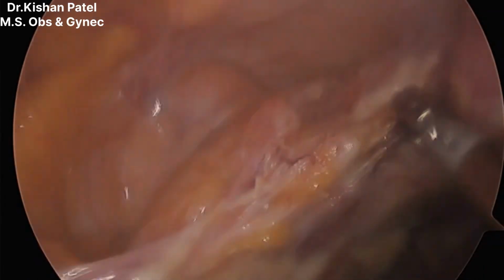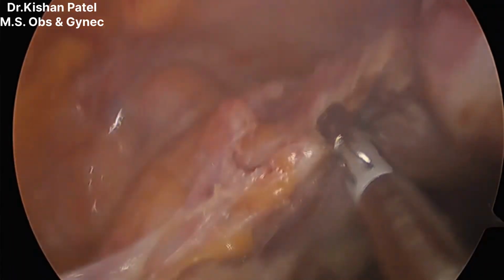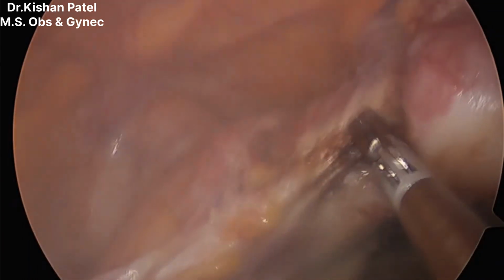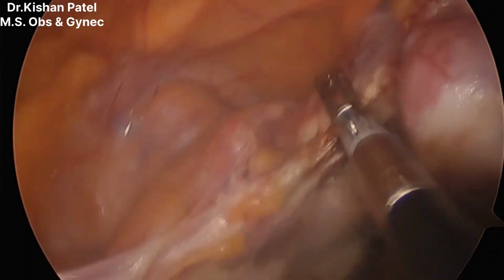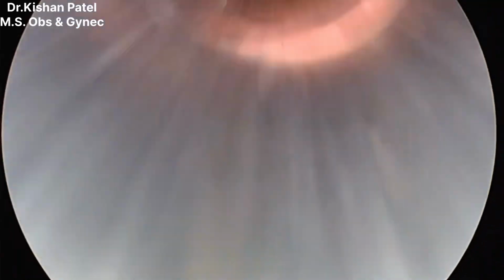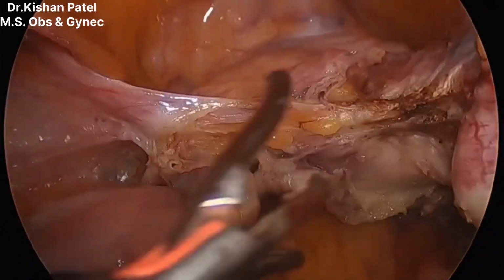As you can see, the color changes, the tissue becomes white after coagulating the uterine vessels. You can also appreciate the uterus color changed.